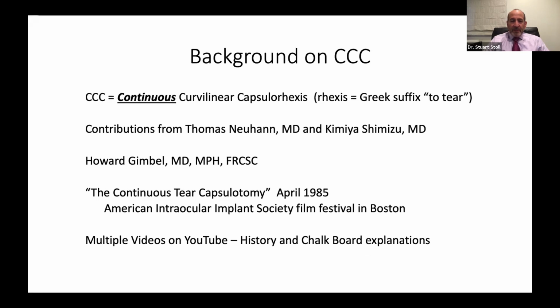I would encourage you to look on YouTube and other sources and read about the history of how he developed this technique, and go and see his old chalkboard explanations, which are just fantastic, how he explains the forces and why the capsule tears in the direction it does. And we're going to try to show that through our simulation videos as well in a little bit different format.